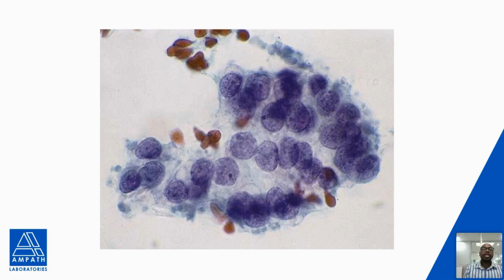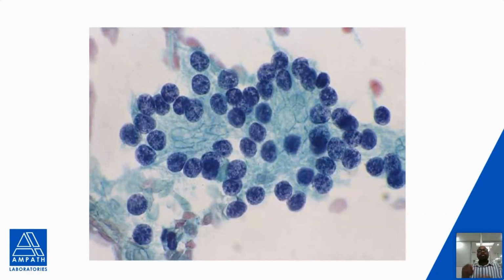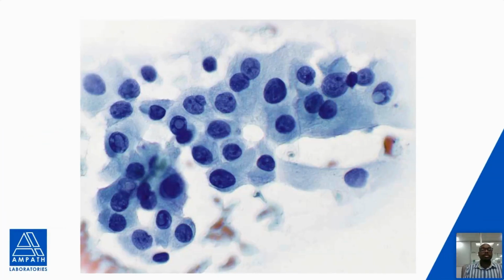Similar with this one, nuclear overlap, nuclear pallor, irregular nuclear membranes. So this micrograph is just to contrast what we saw in the previous slides. So this was follicular adenoma. So the cells lining these follicles, although in areas they look a bit crowded, they are uniform, with regular nuclear contours, and the chromatin is granular. I just put it here to help contrast this from papillary thyroid carcinoma.